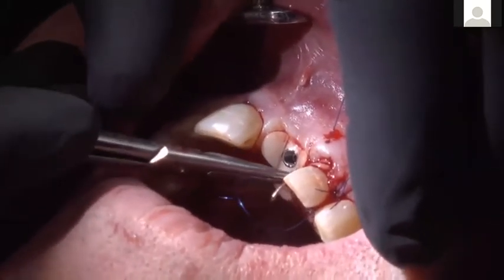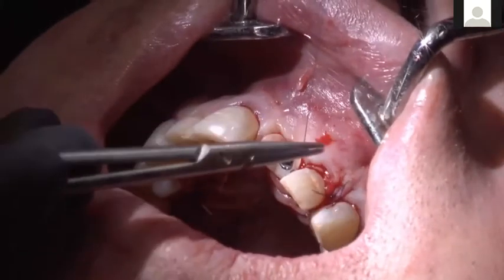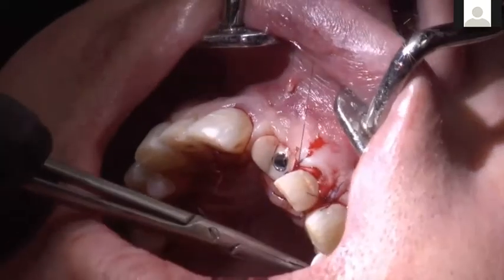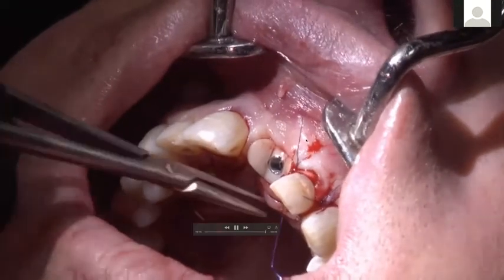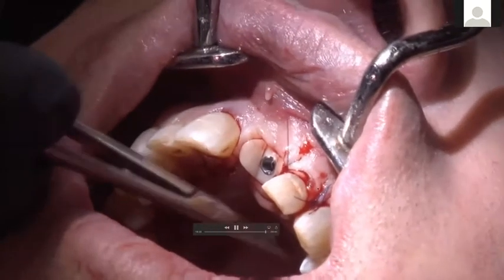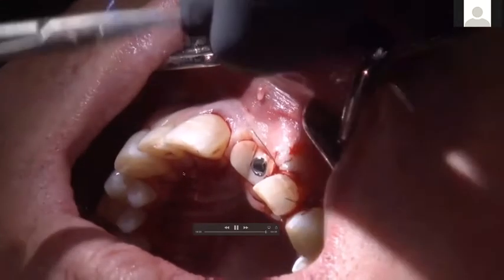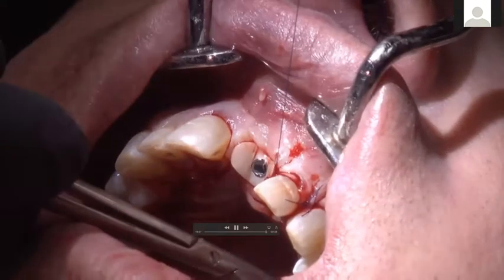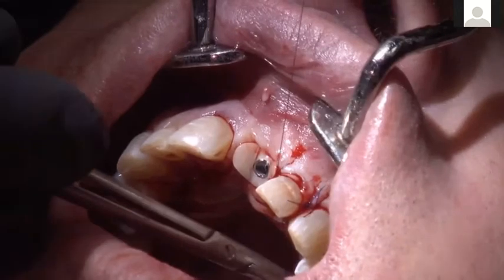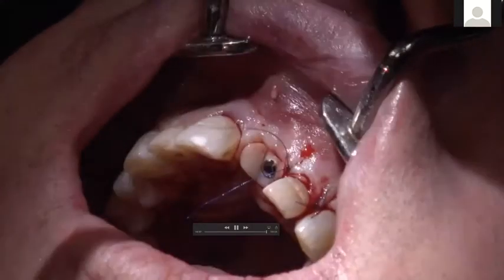Now we just do that last suture there for that distal papilla on number 9 over that connective tissue graft. You can see here the edge of the connective tissue graft. It extends here from number 9 facially underneath the tunnel all the way to number 11 back here. And this is where it came from, if you can see it here in the palate. So here's the suture, just that one papilla, and now we've got our custom tissue former. All right, so this is the surgical video.